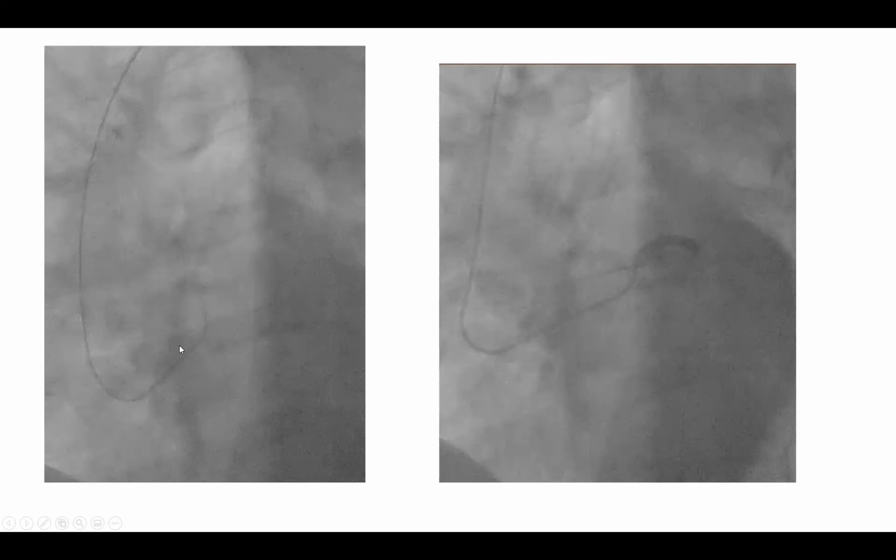This is a case I did last week. It's a patient with a 6.5 centimeter aorta, very large aorta, from a right radial. So this is Jutkins left 5, actually. And look, even Jutkins left 5 is falling down with its tip pointing up. So I use what I rarely use, which is Jutkins left 6, and I was able to successfully engage. So longer arm in this falling catheter with its tip pointing up. Okay.